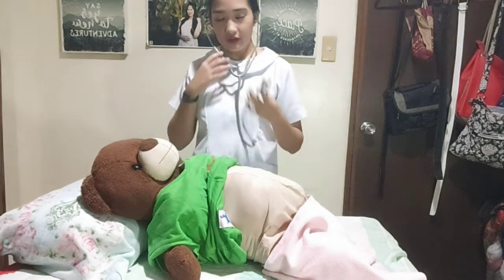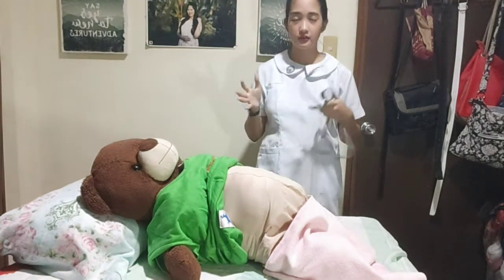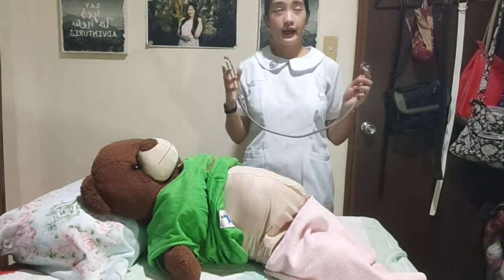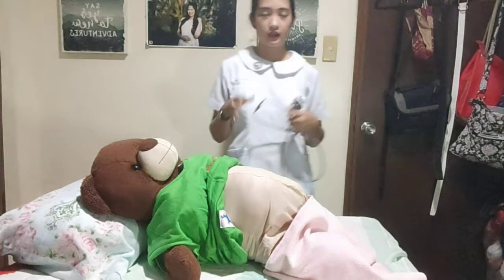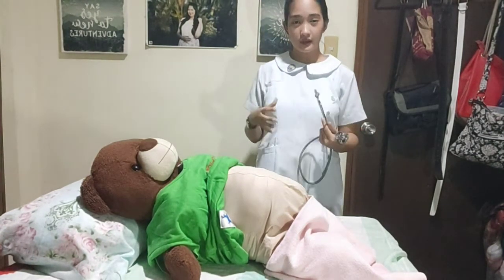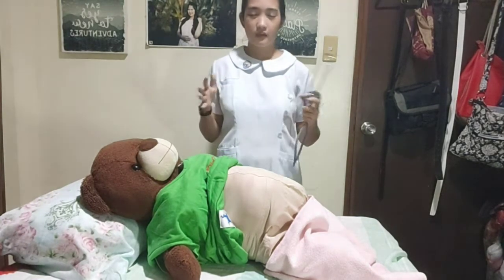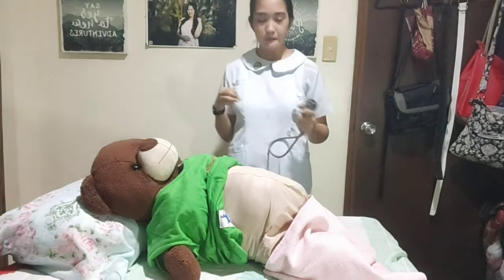So for example, the fetal heart rate of the baby is between 110 and 160 beats per minute. So it is normal, depending on the sources. And if we get the mother's heartbeat between 80 to 85 beats per minute, it is normal. So we will just compare it.